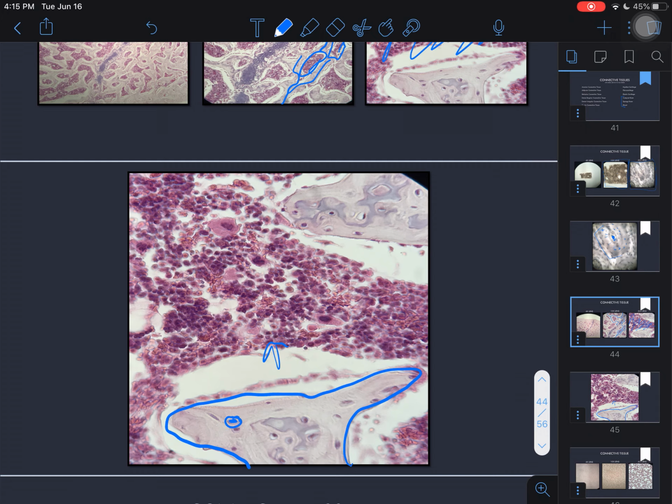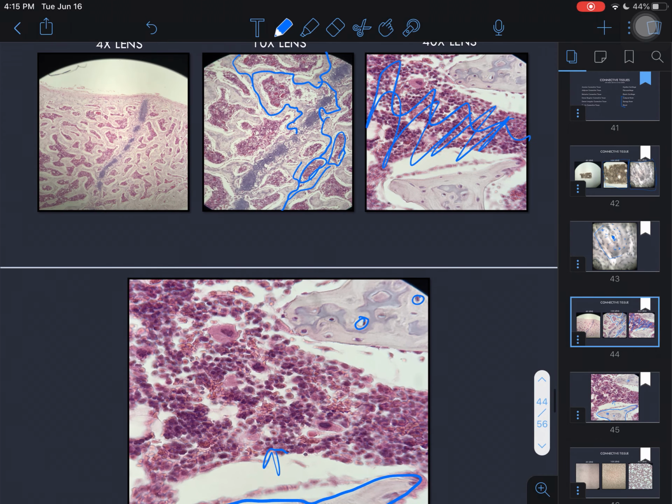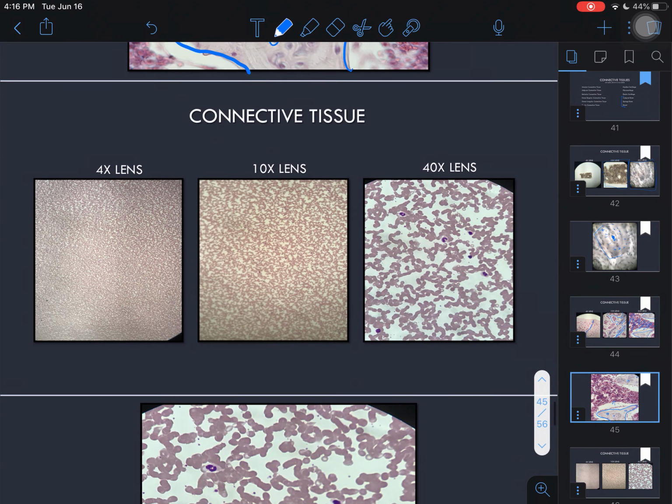And again, you'll see this dark little osteocyte in a lacunae. You'll see them again here, and here, here, and here. You'll see it here, and here, and all of this stuff that I went over in blue earlier. This right here, just as a point of reference, when you get to the bones, right, this guy right here is your epiphyseal plate. You'll talk about that when you get to the bone sections. It's just fun to look at.